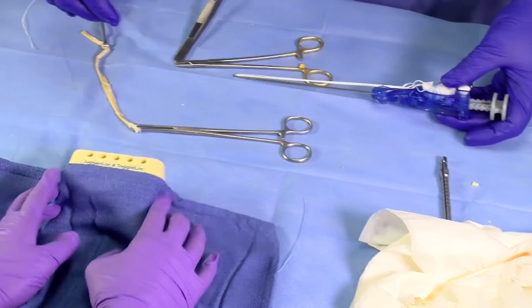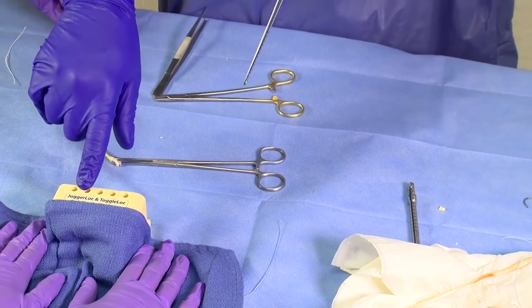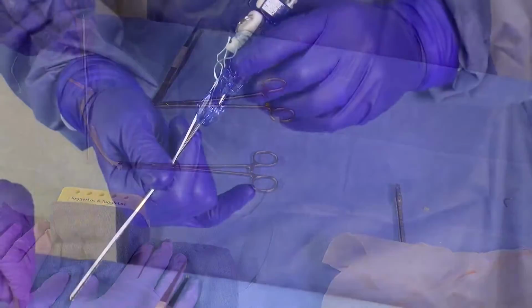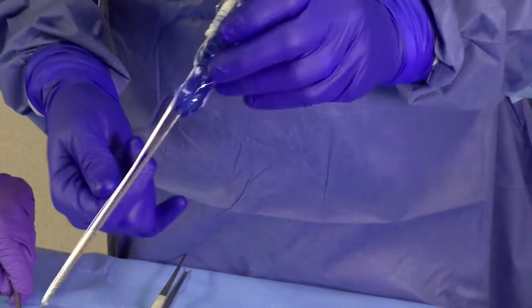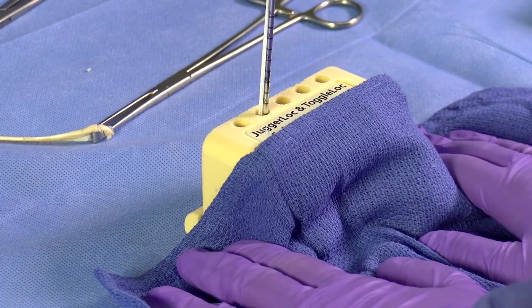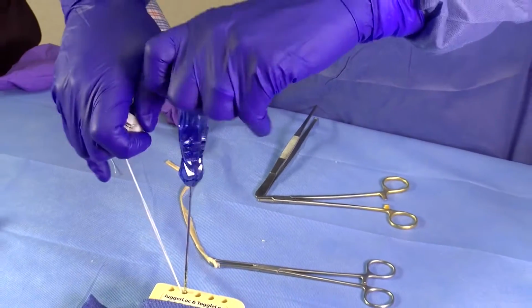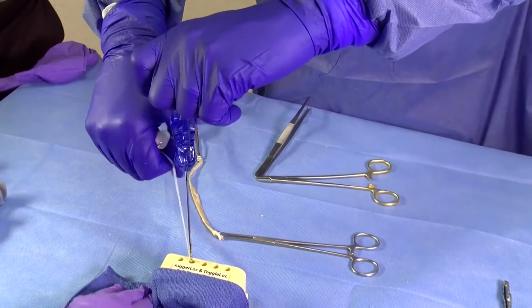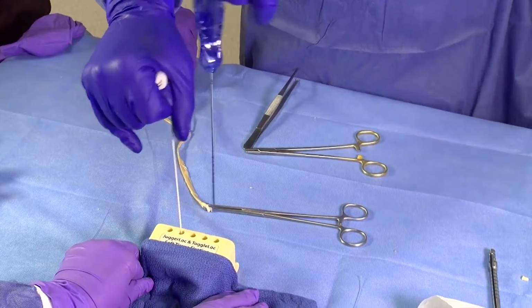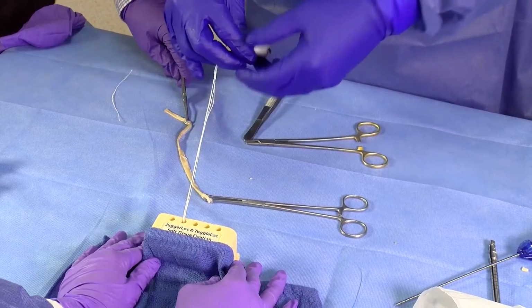If we can imagine, given our block here, that this is going to be our socket in the subpectoral region of the biceps, I will put in the guide and drill the guide pin. I drill my socket, I'll deploy my implant. I'm going to push the button, deploy the implant, and once again we pull back before we remove the inserter to ensure proper deployment.